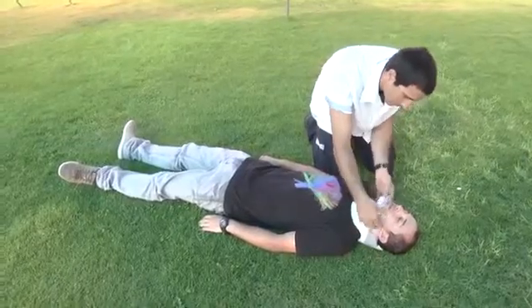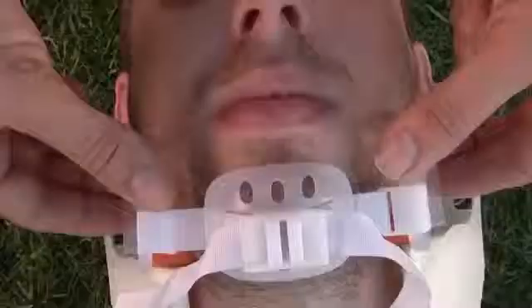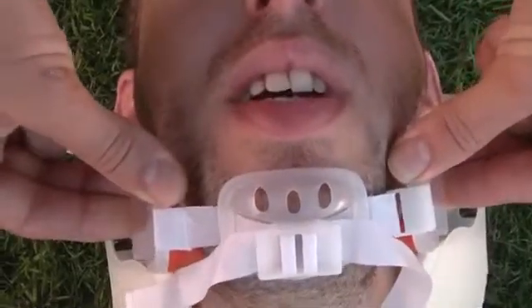Now, if the airway is compromised, pull the mandible holders. By pulling them forward, you are performing the jaw thrust maneuver. Now the patient can breathe.